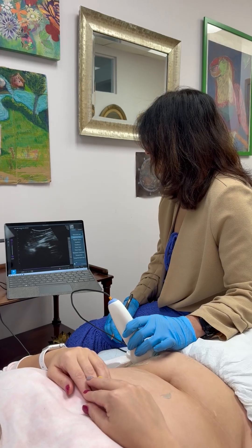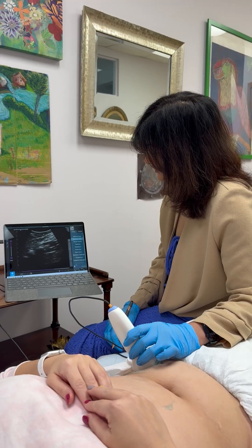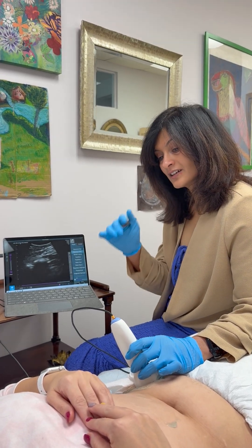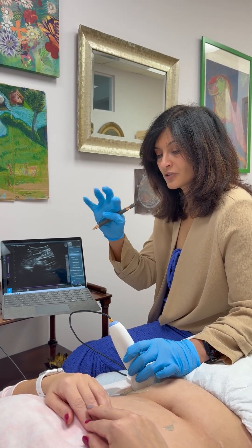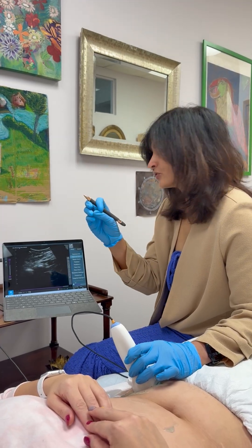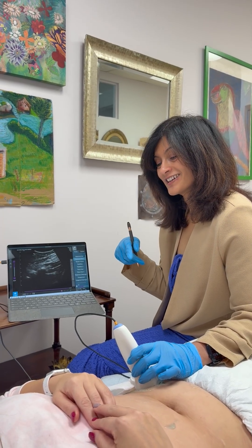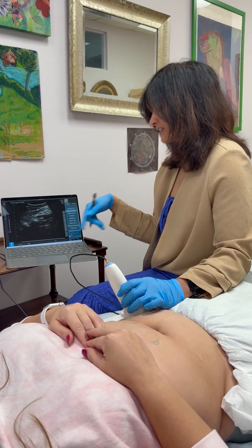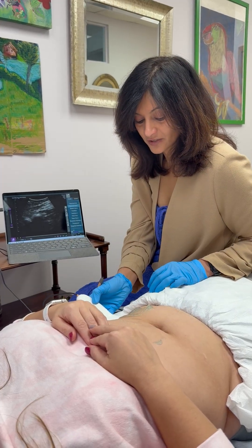You did pretty good with both. The front is harder — I could tell. But the front causes more thickening. When we do the front pelvic floor muscles, the TA usually co-contracts, but the front does it a little more. So when you go to a Pilates class and do a crunch, think of squeezing at the front — you'll get better activation.